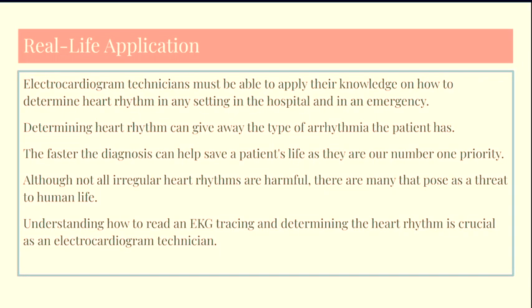Real-life application. Electrocardiogram technicians must be able to apply their knowledge on how to determine heart rhythm in any setting, in the hospital and in an emergency. Determining heart rhythm can give away the type of arrhythmia the patient has. A faster diagnosis can help save a patient's life, as they are our number 1 priority. Although not all irregular heart rhythms are harmful, there are many that pose a threat to human life. Understanding how to read an EKG tracing and determining the heart rhythm is crucial as an electrocardiogram technician.